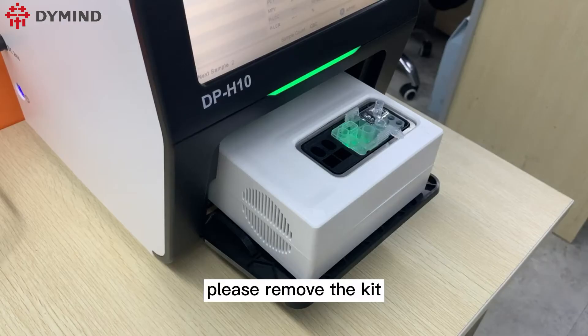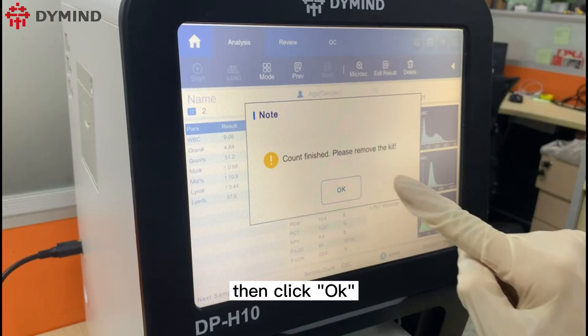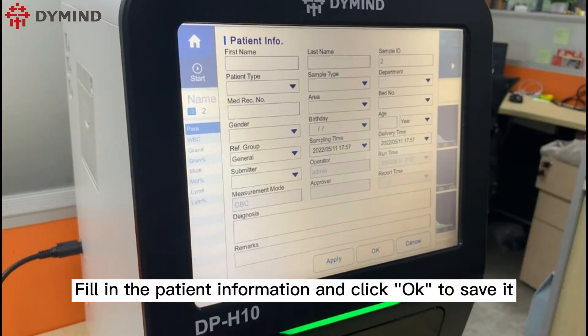After finished, please remove the kit and throw it into the medical waste can, then click OK. Fill in the patient information and click OK to save it.